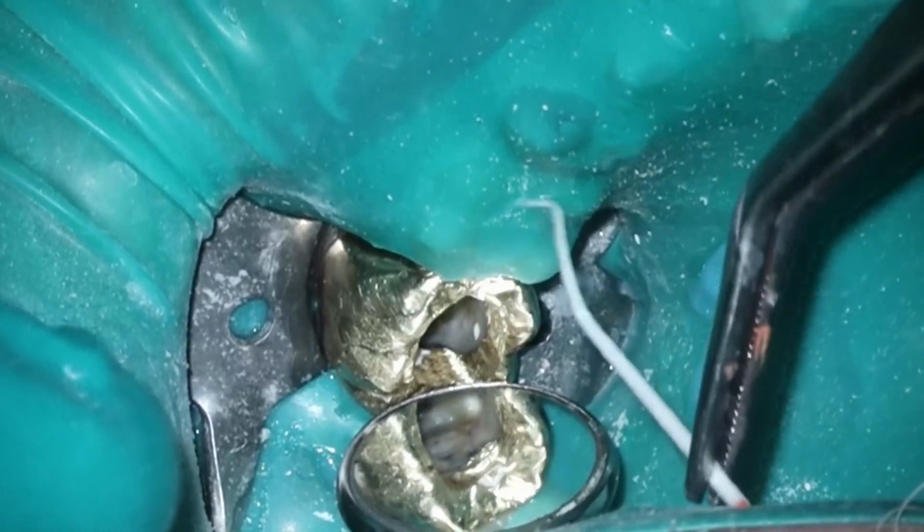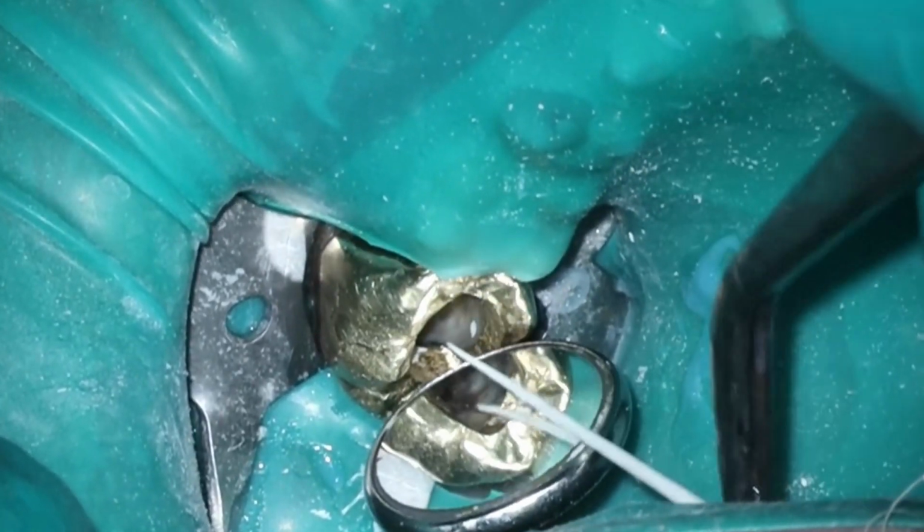Now, my working length here, I believe, was 21. And what I generally do is I'll take the 2006 down, let's say if it's 21, I'll probably go down about 16, 17 millimeters, give or take, just so that I give enough space that the cannula of my beta can fill it inside there. You'll see it's even tough for me to get the picture. That's how little space there was. So I do understand why the access was difficult for the general dentist, but my major complaint is that it should have never been done in the first place.